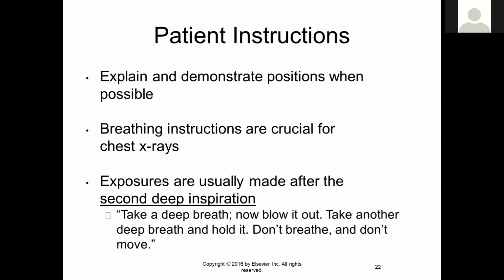When possible, you want to explain and demonstrate the positions that you want your patient to stand in. And you are also going to give clear breathing instructions. This is super important for chest X-rays. We make these exposures for chest X-rays after the second deep inspiration. So an example of what you would tell your patient is below.